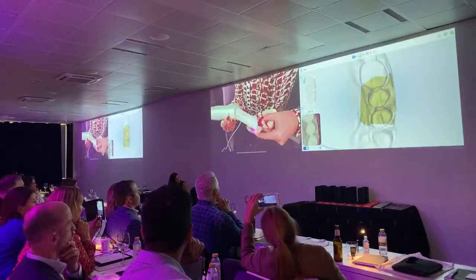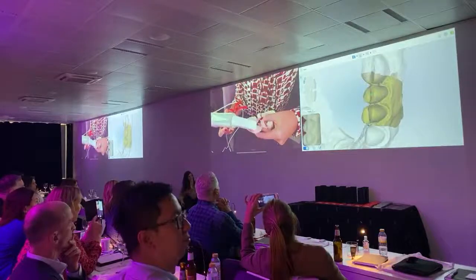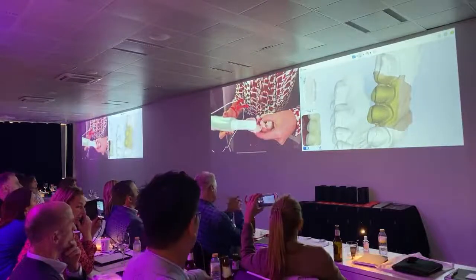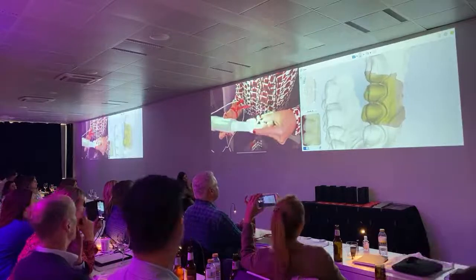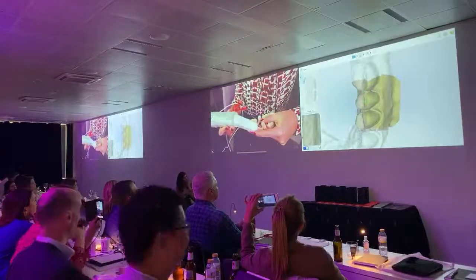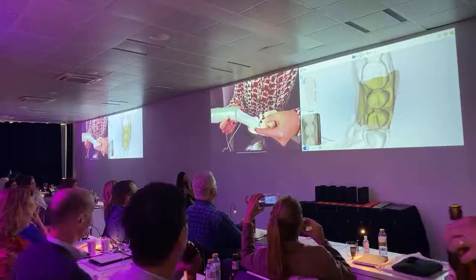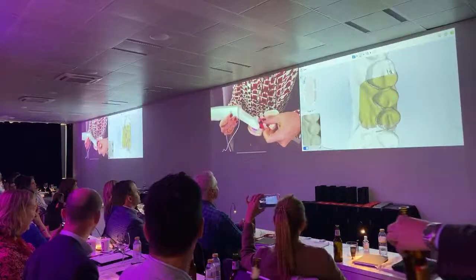If you're scanning an abutment, you also place it on the occlusal of the abutment. And then I turn to vestibular very slowly. Sometimes I stabilize my camera with my other hand. That's why I don't shake, because in Brazil I'm not allowed to drink wine before seeing patients, so I'm not at my best performance right now.